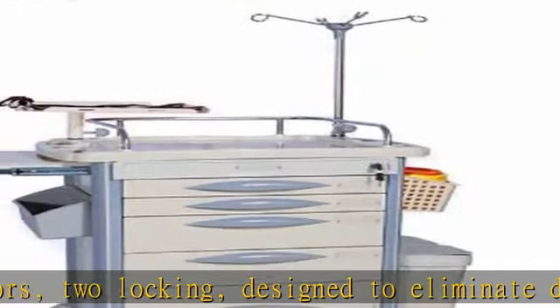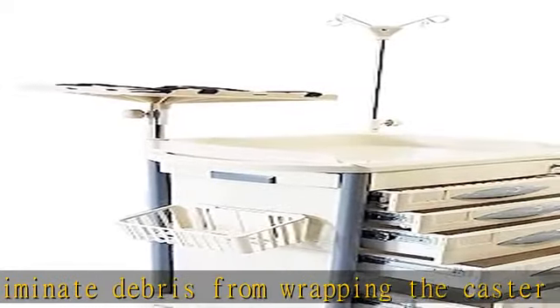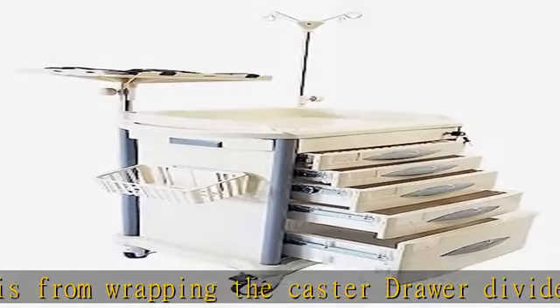2 medium drawers: 16.5 in W x 14 in D x 5 in H.